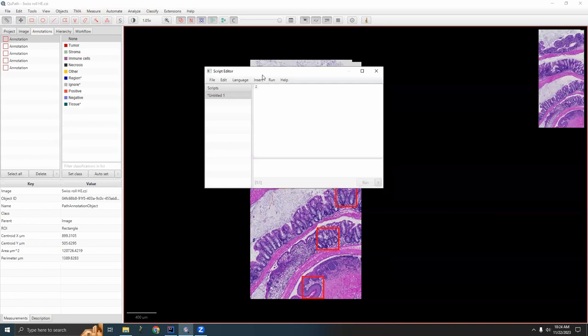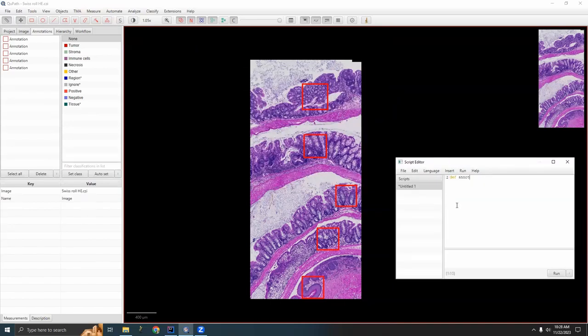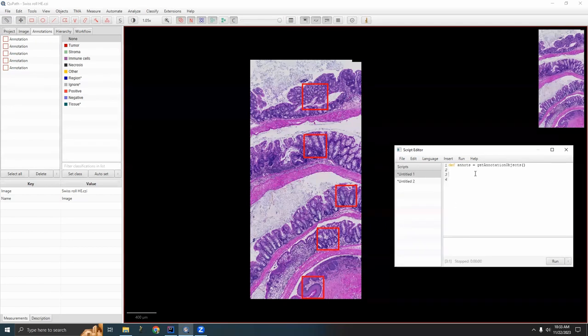So let's get started in the script editor and first start by calling all of my annotation objects. And this part should feel familiar by now. From here, the general way in which you would name everything is to use a loop, like the .each statement. So you would go annots.each, it.setName, and then type something here. But unfortunately, the way you have this set up, it would give every annotation the exact same name. And I want to have some sort of increasing increment to name them regions 1, 2, 3, 4, 5.